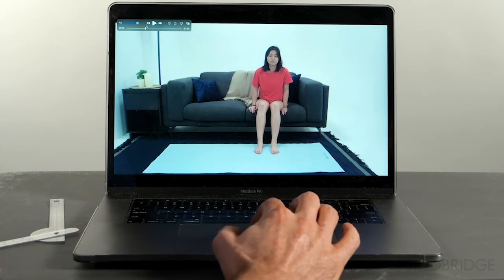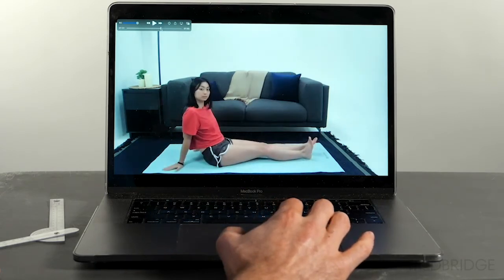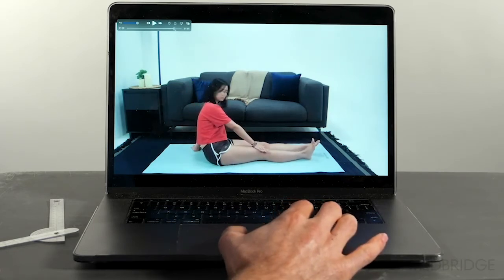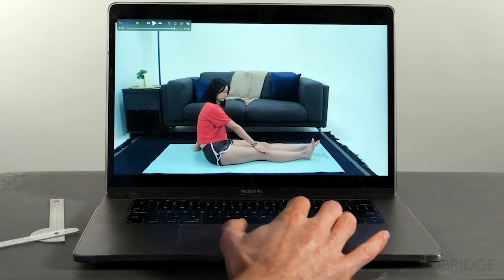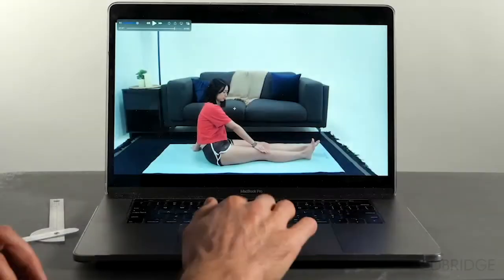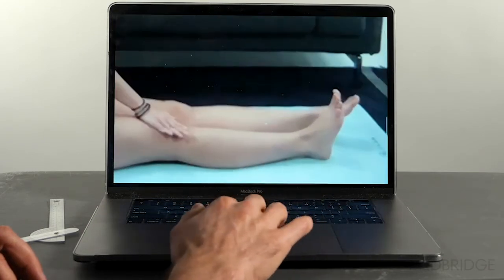One option is to measure range of motion on the screen. As you can see here, I have Julie's telehealth visit pulled up and she's going through ankle dorsiflexion range of motion. She stabilizes her femur and right about there that's her end range. I'm going to take a screenshot, and I can either measure range of motion on the screen in the video while she's going through her range of motion, or the screenshot allows me to zoom in further on her lower limb to make the measurement easier.